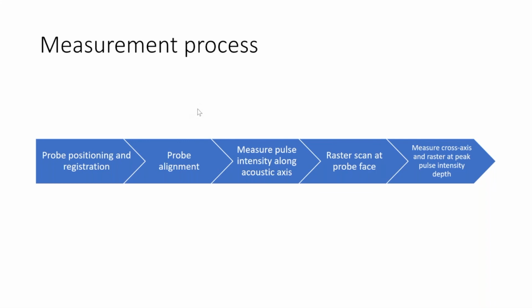I think the mitigating factor is that the derating factor of 0.3 decibels per centimeter per megahertz is quite conservative, and so it's higher than passing only through, for instance, bladder, but skin is much higher, probably 4 or 5 times higher than that. Yes. And then the layers, in order to get to the bladder, you're passing through connective tissues, fat, muscle, all of which have higher levels than 0.3 decibels per centimeter per megahertz. So in that regard, there could be a case where it would be higher, but I think by using a conservative choice of derating factor, that's rarely going to be an issue or a concern.